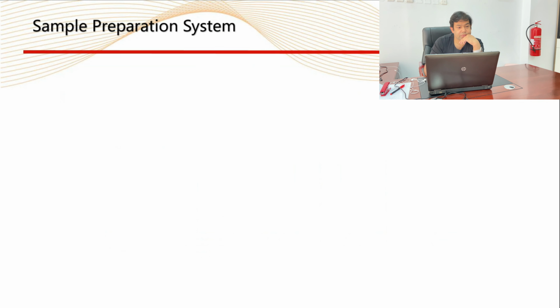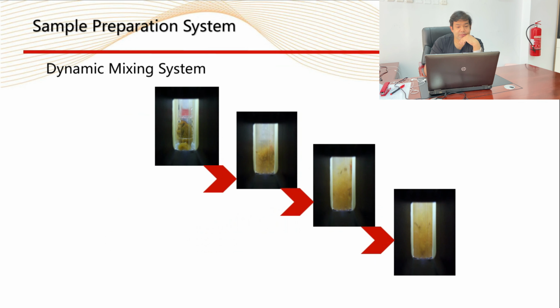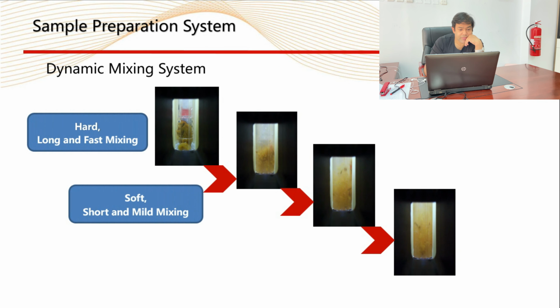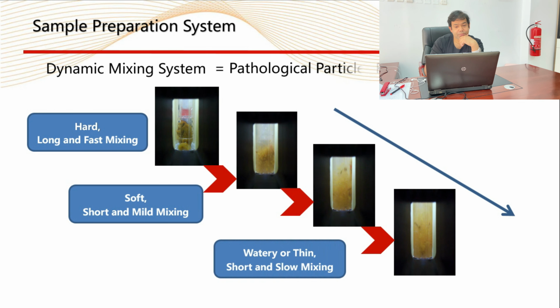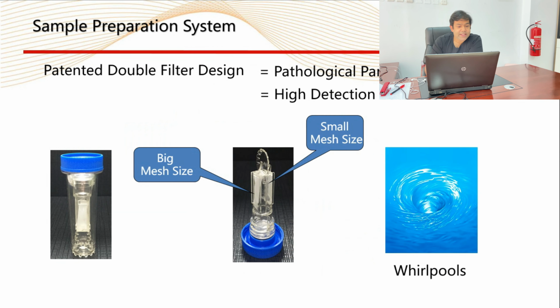Sample preparation system, dynamic mixing system. So these are the stages. You can see that if it is hard, long and fast mixing; soft, short and mild mixing; and if it is watery or thin, short and slow mixing. Same as this is the patented double filter design.